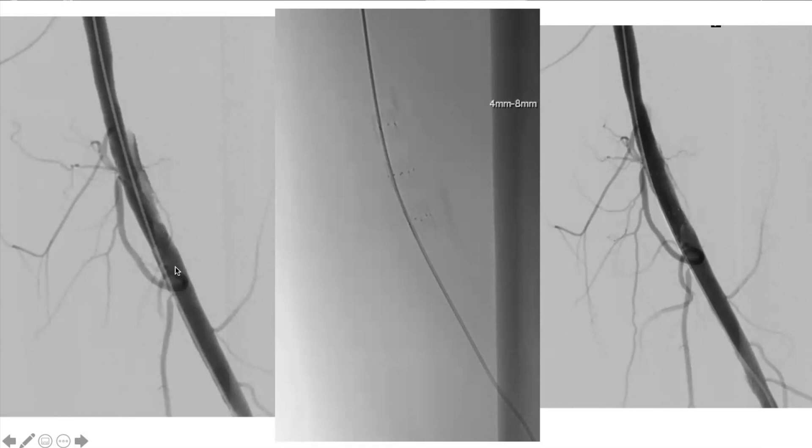TACK devices are little focal dissection repair stents — not a full-length stent. You can put as many as you want: one, four, six. I put them in the AT and also in the SFA where there was a dissection flap as well. In the past I would have put a bare metal stent or a covered stent spanning at minimum four centimeters, but with TACKs I can just cover that flap precisely.